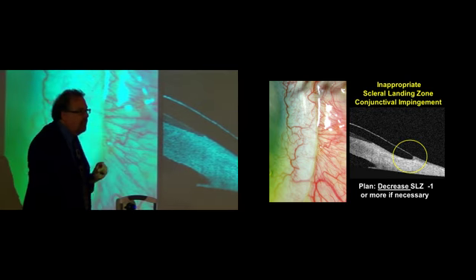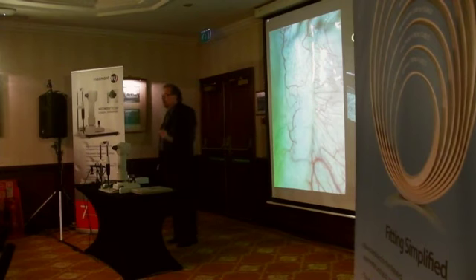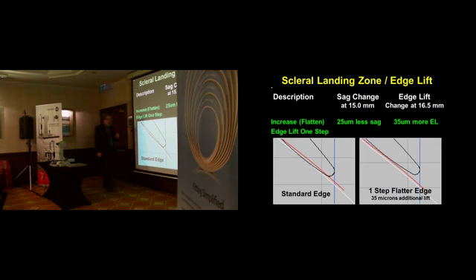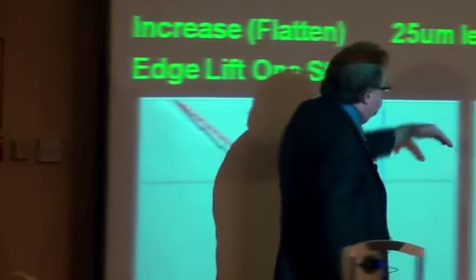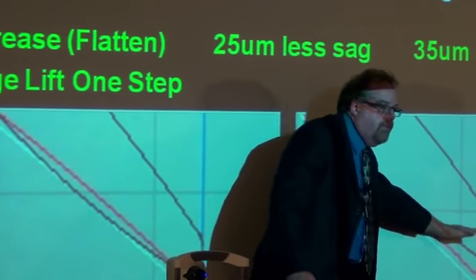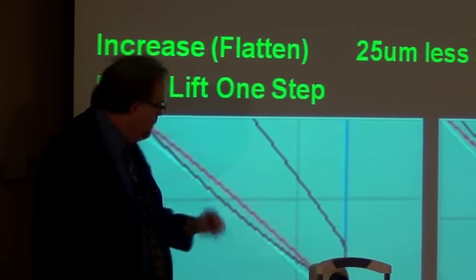What you need to do here is, if you see any impingement of the conjunctival blood vessels, you need to communicate this to number 7. What they will do is they will open up that periphery in 1 degree increments.